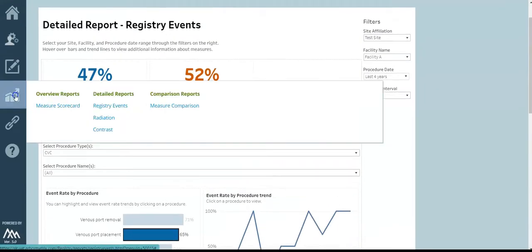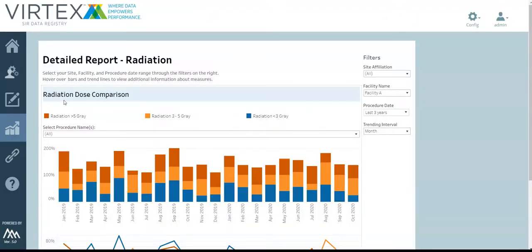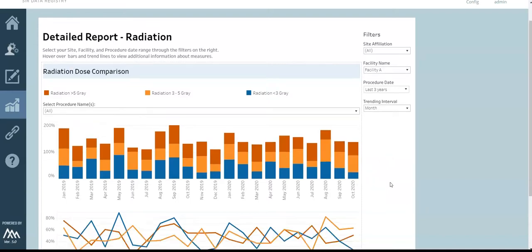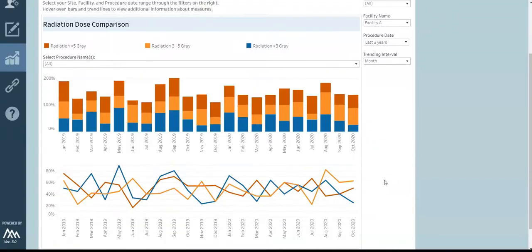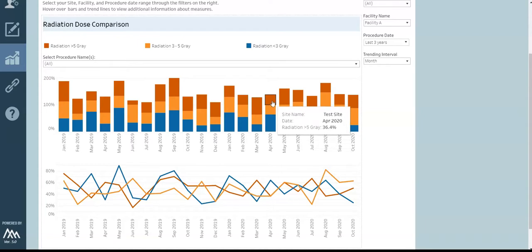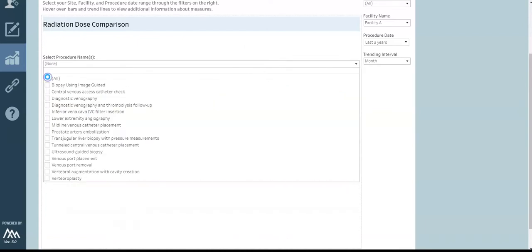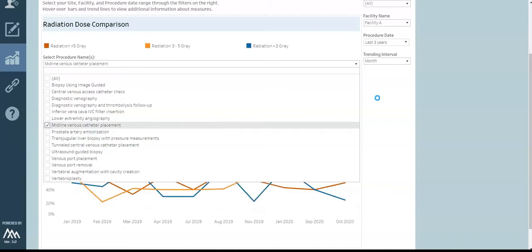Next, let's navigate to the radiation details report by clicking the trend chart icon on the left of the screen. Here you can see a radiation dose comparison over time. Again, you have a variety of filters, including site, facility, procedure date, and trending interval. You can select a specific procedure you want to learn more about.